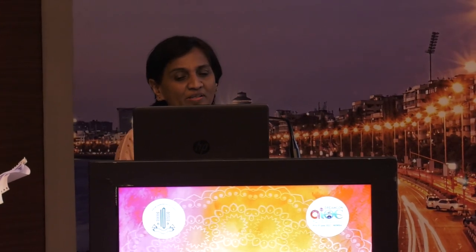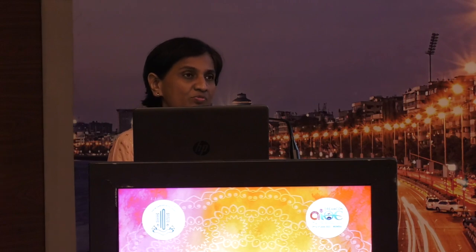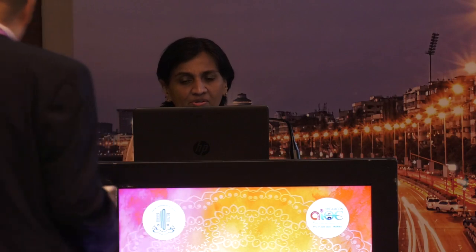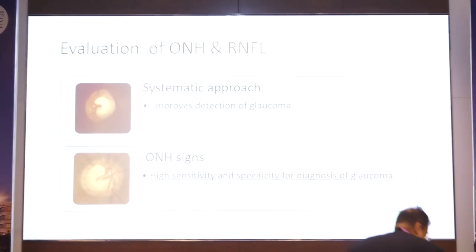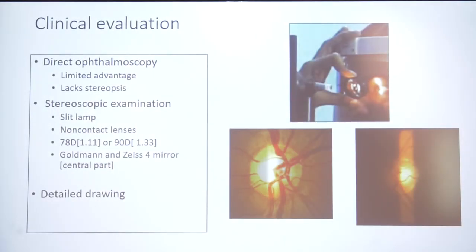ONH signs in glaucoma can be very subtle — we cannot see what the brain doesn't know. We have to be careful and know all the signs of glaucoma. Here you can see thinning of the NRR with a subtle retinal hemorrhage inferiorly at 6 o'clock. A systematic approach is important and improves detection of glaucoma. ONH signs have high sensitivity and specificity for diagnosis.